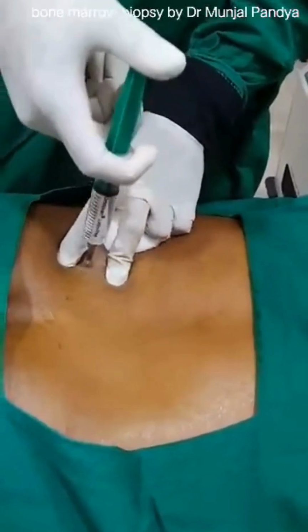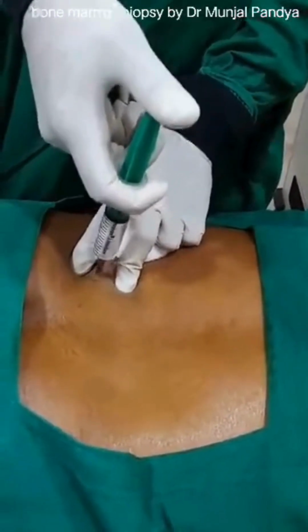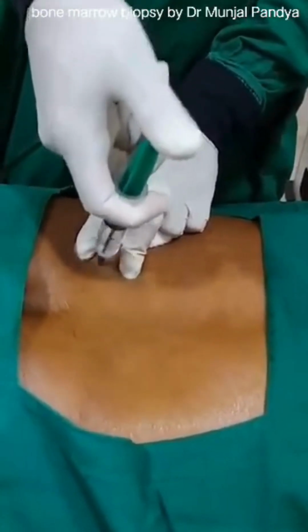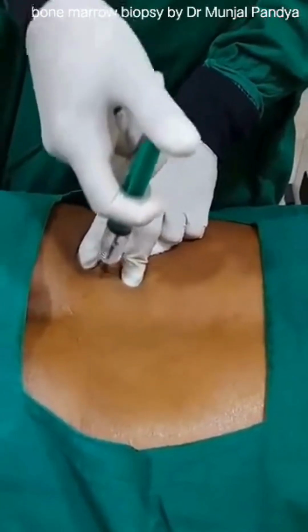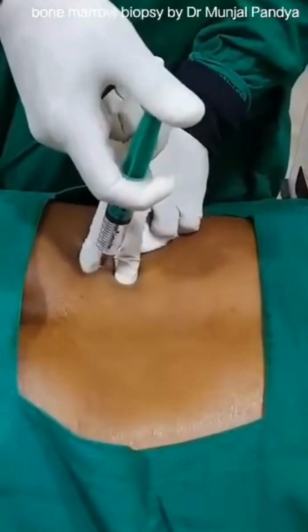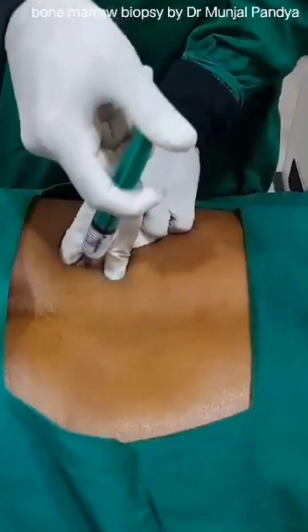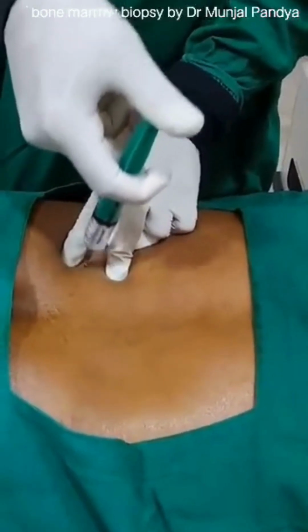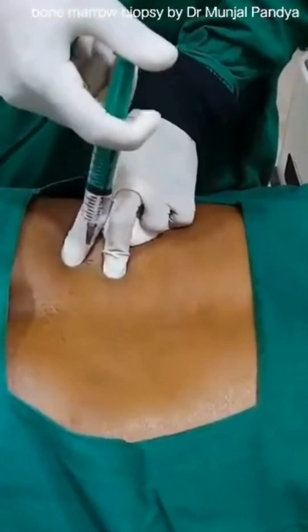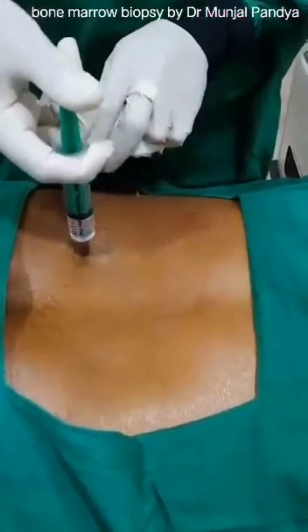I am moving my needle with the syringe which contains 10 cc of 2% xylocaine local anesthesia. Bone and periosteum are the most sensitive parts for pain, so you have to give good local anesthesia to make the whole procedure pain free. Many times we can give even more local anesthesia. You can give even 15 to 20 ml in some sensitive patients, but most of the time 10 ml is more than enough.